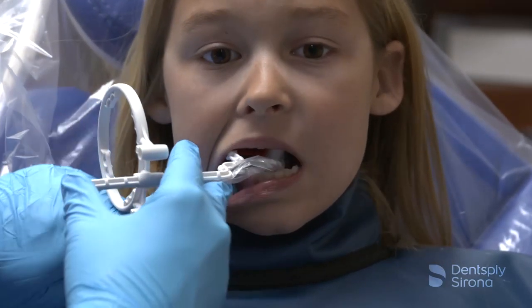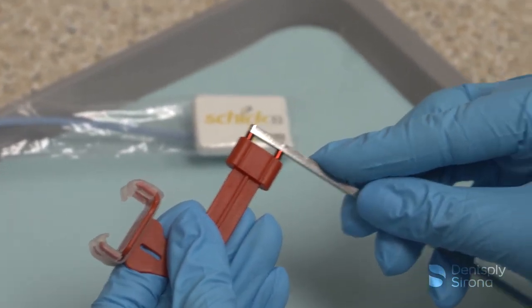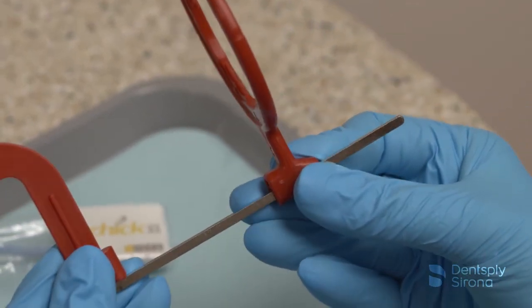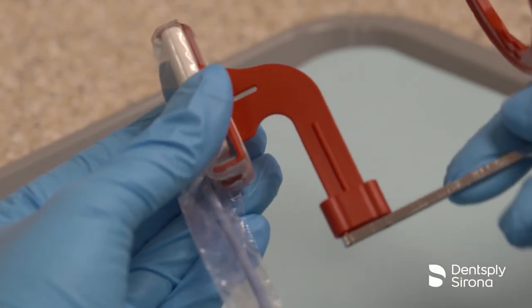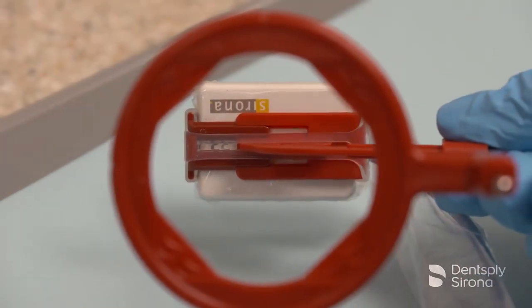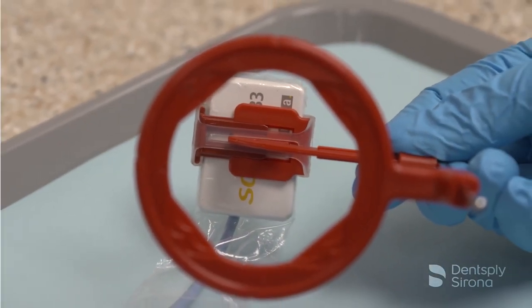On premolar bitewings, center the image receptor behind the second premolar. To assemble the XCP-DS-Fit bitewing bite block, place the red pins on the arm into the side of the red bite block and slide the arm into the aiming ring. After placing the sensor into a RIN digital sensor cover, securely insert the sensor into the red bite block, making sure the active side is against the flat surface. If taking horizontal bitewings, the sensor will be placed in a horizontal position; in a vertical position if capturing vertical bitewings.